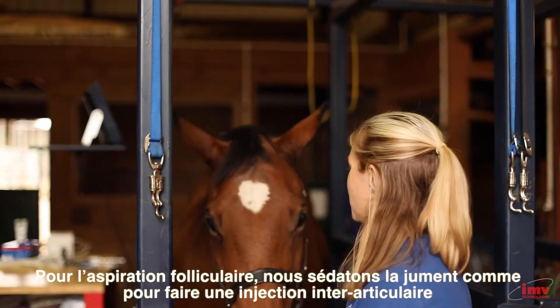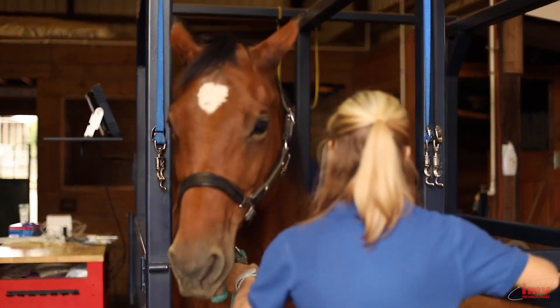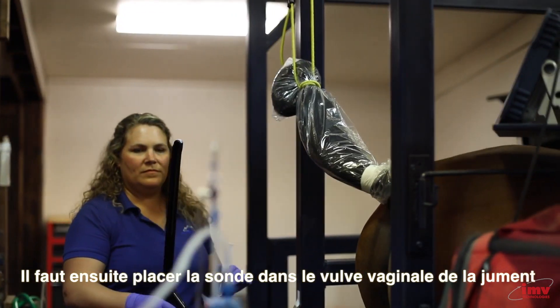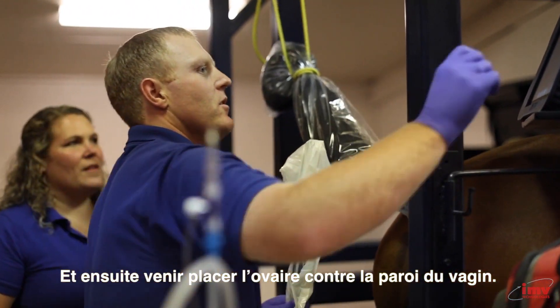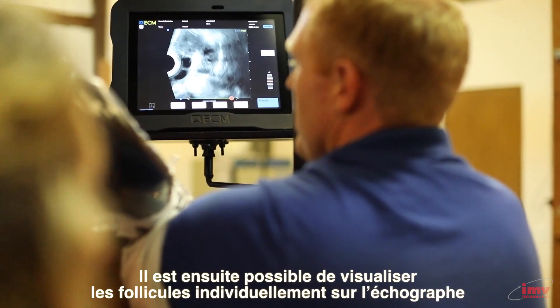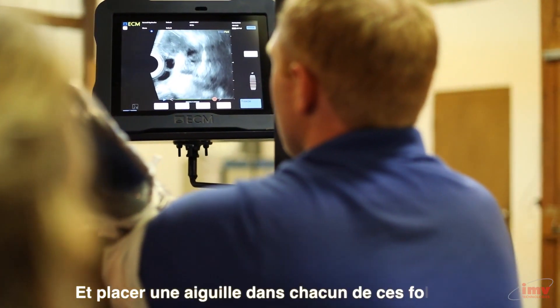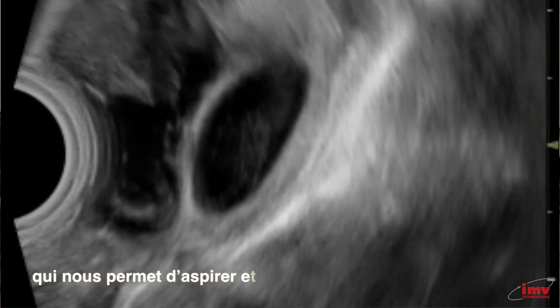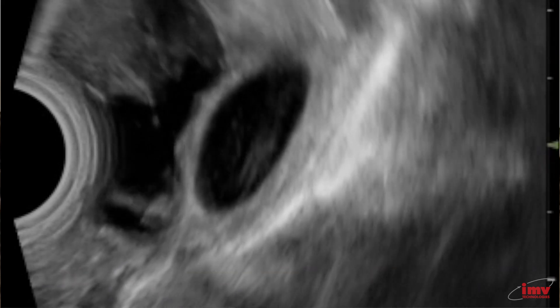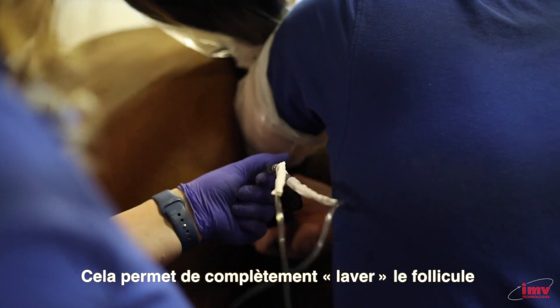For oocyte aspiration, we sedate the mare much like you would for joint injections. We then place an ultrasound probe in the vaginal vault of the mare and bring the ovary against the vaginal wall. We can then visualize the individual follicles on ultrasound and place a needle inside of each one of these follicles. The needle is a double lumen needle, allowing us to both aspirate and inject fluid at the same time, which allows us to wash the follicle completely.